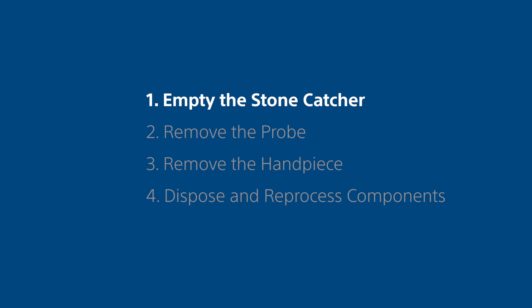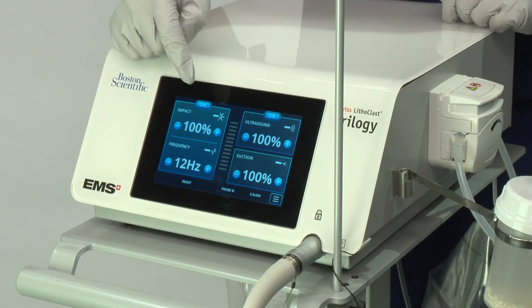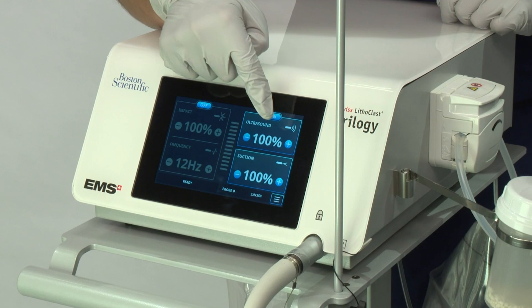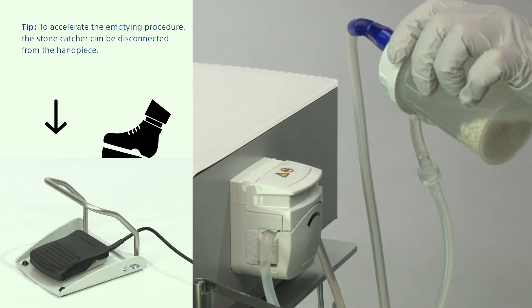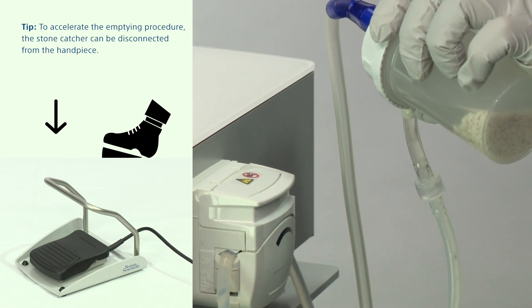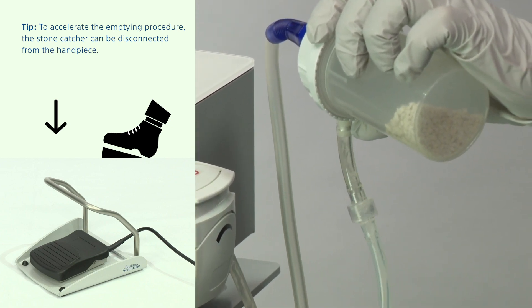Step 1: Empty the stone catcher. Do not disconnect the probe and handpiece at this stage. Switch off the impact mode and the ultrasound mode from the ready screen. Tilt the stone catcher. Press the pedal halfway for a few seconds to empty the suction circuit and reduce the level of water in the stone catcher.